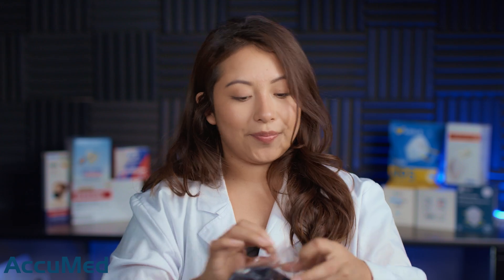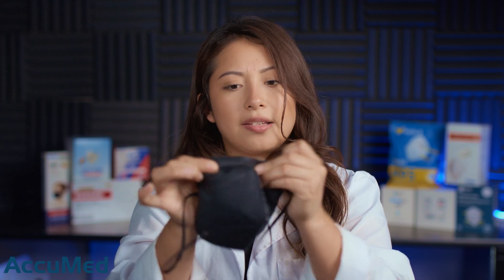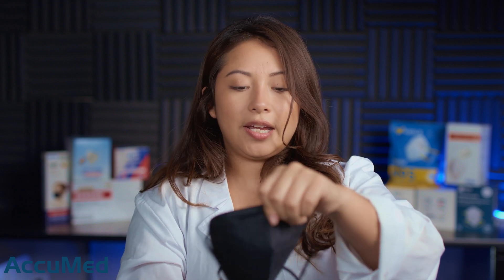Let's go ahead and take a look at these before we run them through our TSI machine. They have a soft silk outer layer, and the nose wire is actually not too bad — it's not very flimsy. Let me try this on and see how they fit on my face.